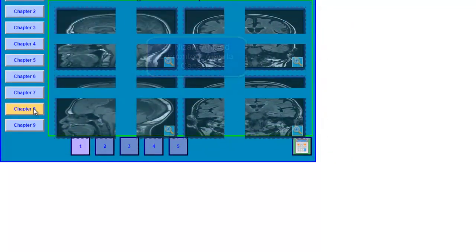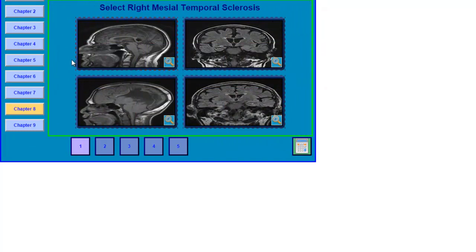Chapter 8 is Imaging in Epilepsy. Mesial temporal sclerosis is a finding that is quite common in patients with temporal lobe epilepsy. If you identify a patient with mesial temporal lobe sclerosis, this person can be a good candidate for epilepsy surgery provided that the patient has not responded to medications. What you have to do is click on the image that shows mesial temporal sclerosis.